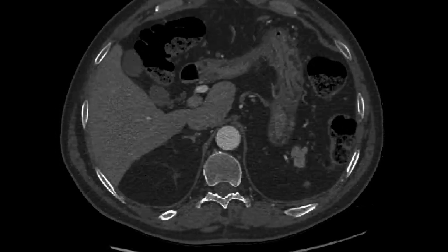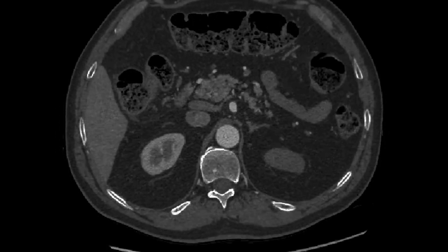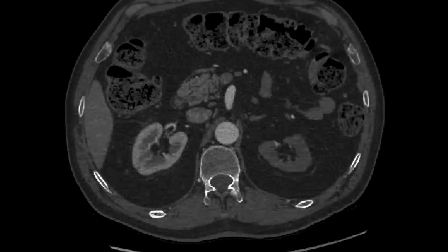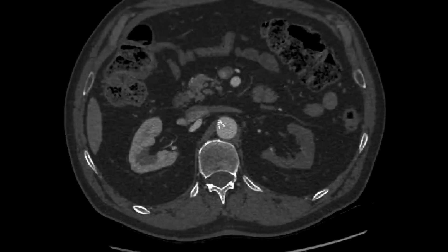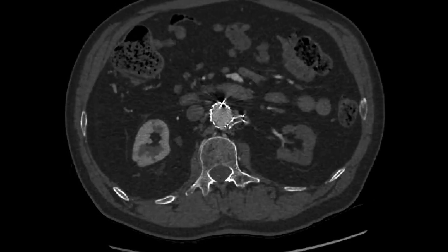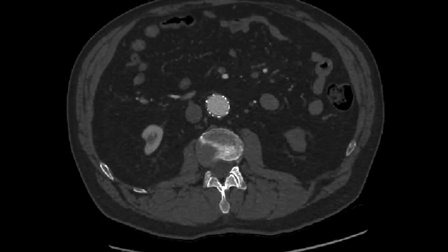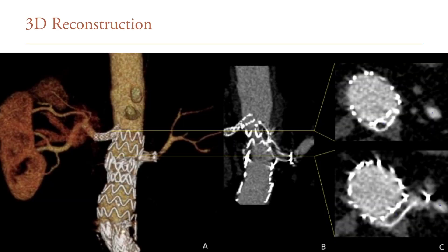Here we see an axial view of the preoperative CTA. Evident here is the previously placed aortic stent graft and an occluded left renal artery snorkel graft. We also see that the left kidney is hypoperfused compared to the right side. Here's a 3D reconstruction highlighting patency of the native renal artery distal to the thrombosed stent graft.